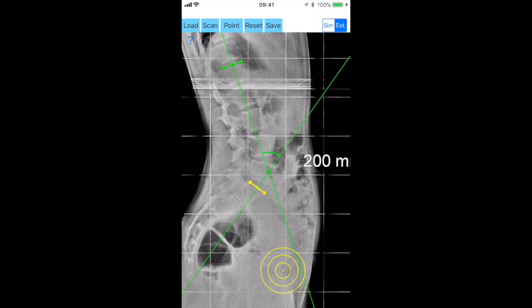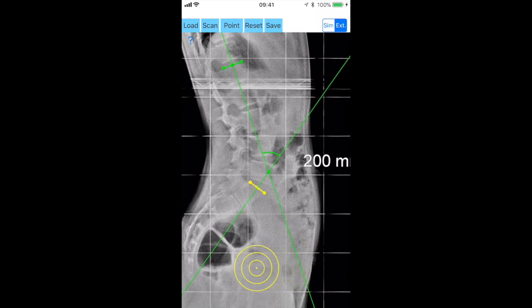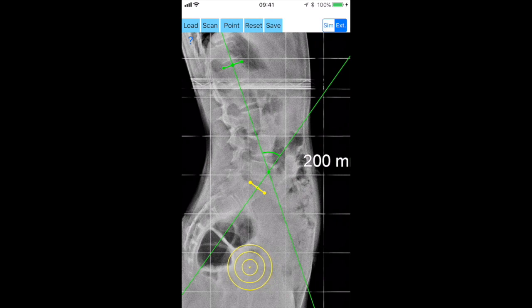Next you aim at the center of the femoral head, and by clicking the point button you mark the center of the femoral head, C5.